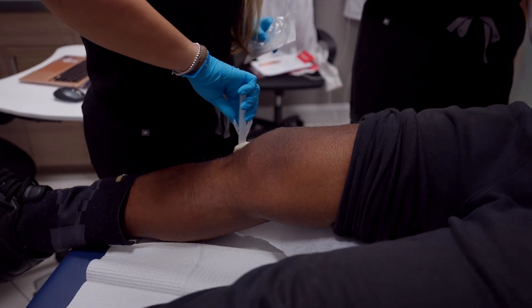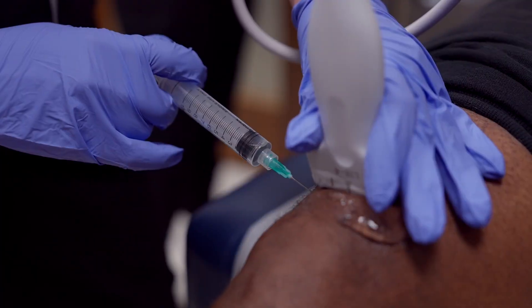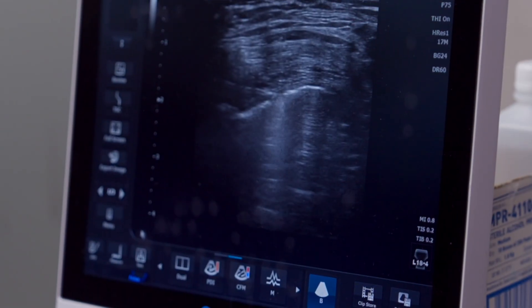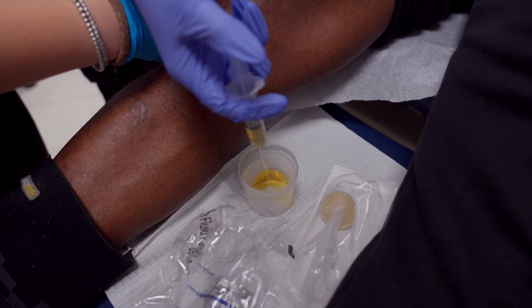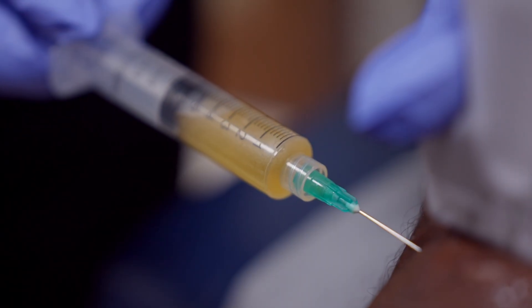If there is an excessive amount of fluid, we do advise the patient if they want to get that aspirated. In this situation, we did aspirate about 25 cc's of fluid. That should definitely help with his extension and flexion in the knee, hopefully helping him walk around easier and doing any daily activities using his knee.